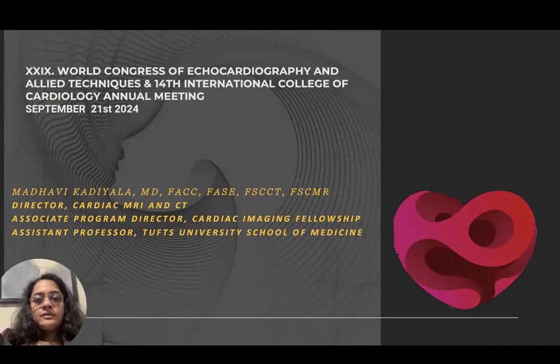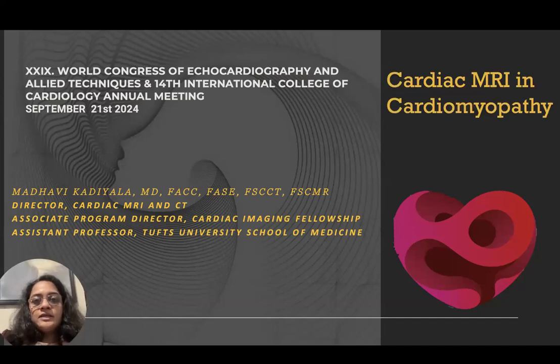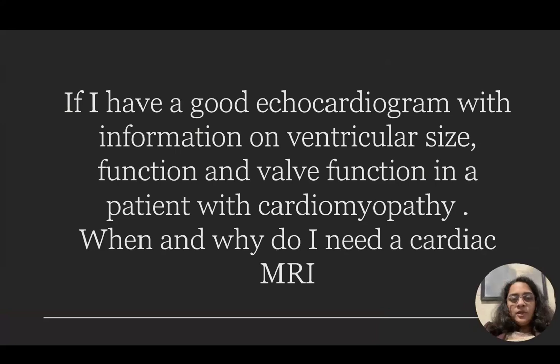Today, I will present a brief review of cardiac MRI and cardiomyopathy, focusing on the recent update. I have no relevant disclosures. The question is, if I have a good echocardiogram with information on ventricular size, function, and valve function in a patient with cardiomyopathy, when and why would I need a cardiac MRI?